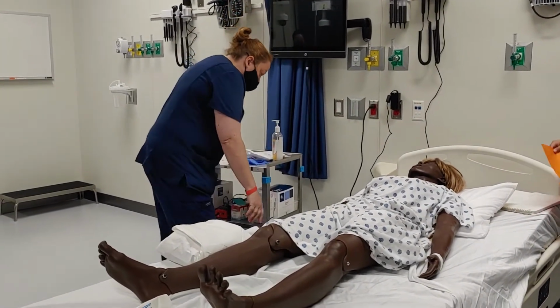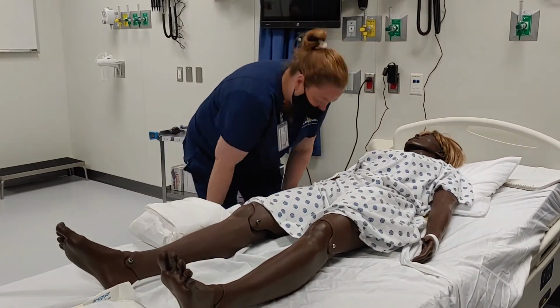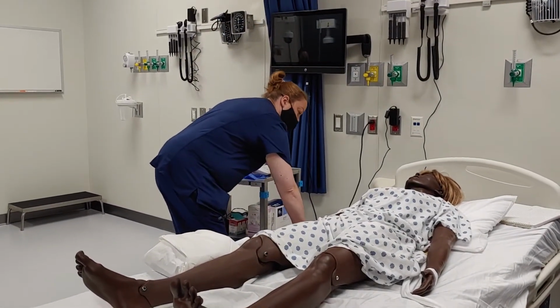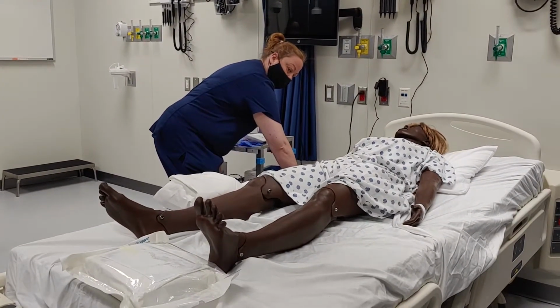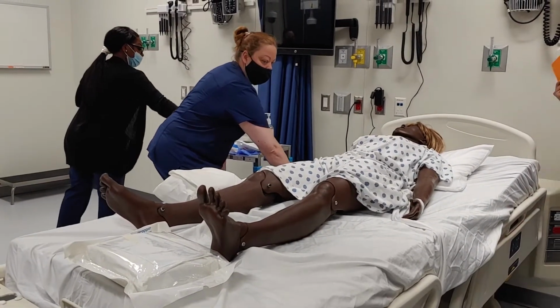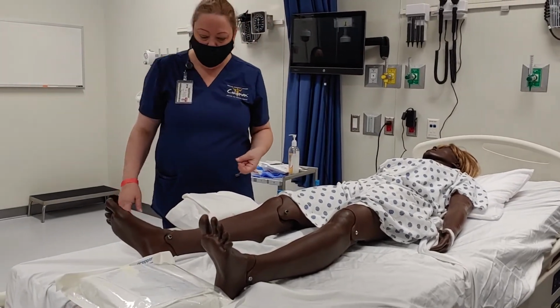The next thing we want to do, we want to get them to an appropriate height for us so we're not sitting here bending over them and breaking our back. All right? So we're going to get them up to an appropriate height. And that's pretty good right there. Right about your waist level should be pretty appropriate.